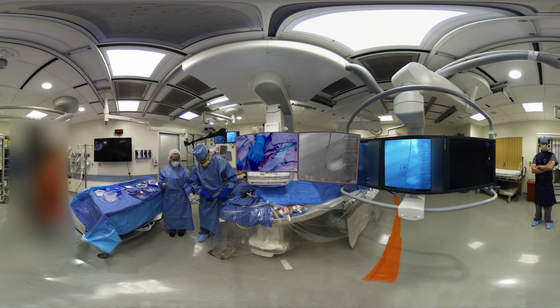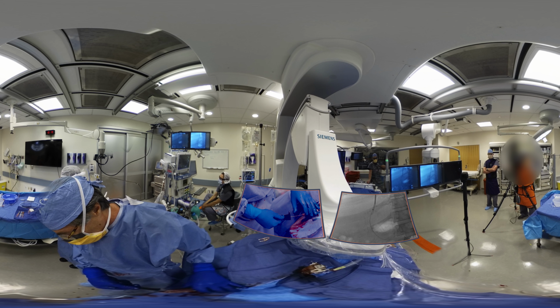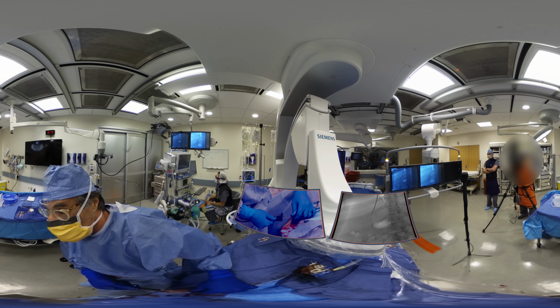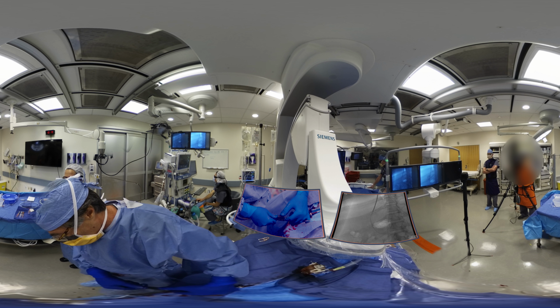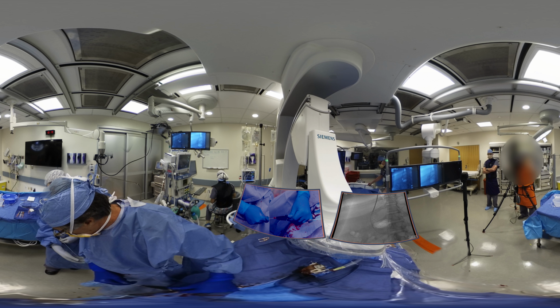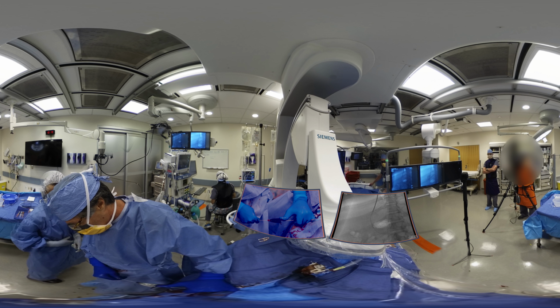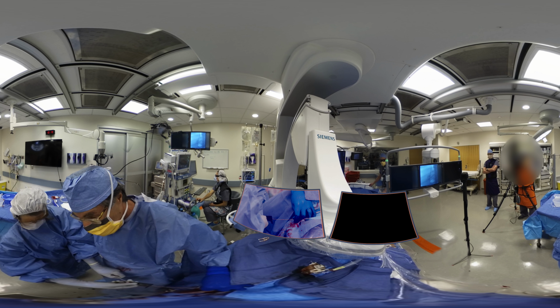We'll first take out the torque device, and I'm going to firmly pinch the guide wire so that it doesn't slip between my fingers. And then we're going to remove the needle, but focus upon keeping the sheath in place and also keep track of our guide wire. So I'm going to keep the needle sheath in place. I'm going to ask my colleague to back out the needle. So go ahead and reach around. Yep. We're going to pinch pull. I have the guide wire.